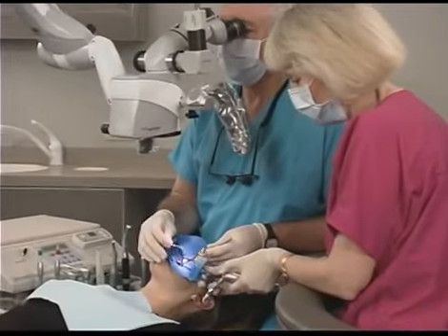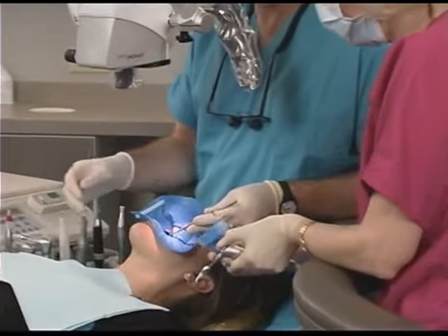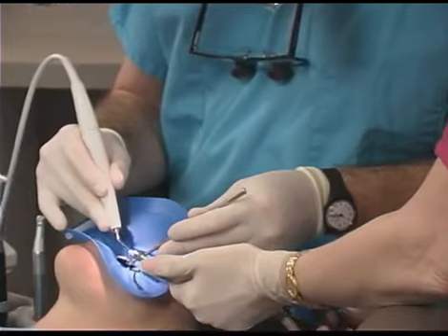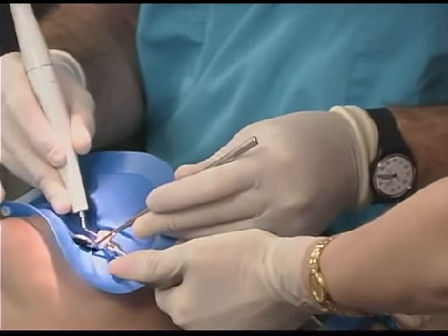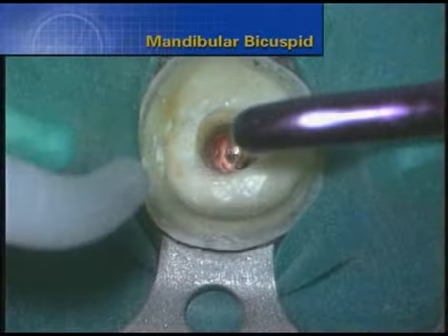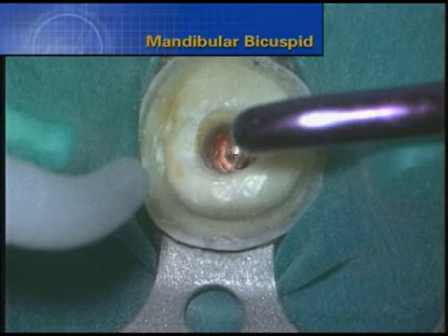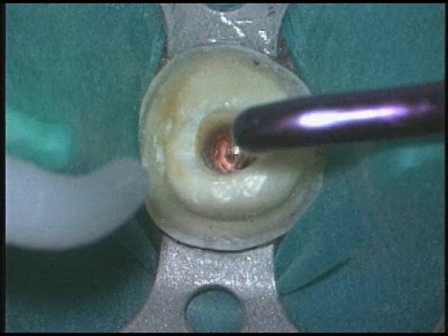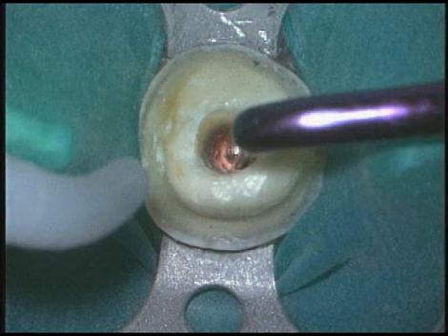In combination, microscopes and ultrasonics have driven microsonic techniques that have improved the potential, predictability, and safety when removing broken instruments. Let's take a look. Here's a case we saw earlier in the show where we removed a crown and post. Let's watch how to remove a broken instrument in the apical 1/3 of this root canal.